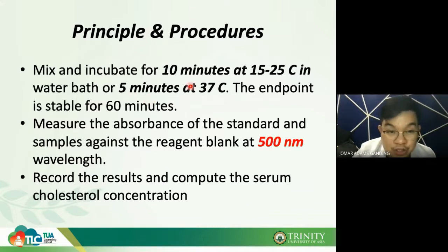After incubating for 5 minutes or 10 minutes, depending on the temperature that you use, the endpoint solution can be measured within 1 hour or 60 minutes because it's only stable for 60 minutes. So we need to measure the solution at an absorbance of 500 nanometer. We need to measure the absorbance of the standard, the sample, and the reagent blank at 500 nanometer. Remember the wavelength that is being used, 500 nanometer.